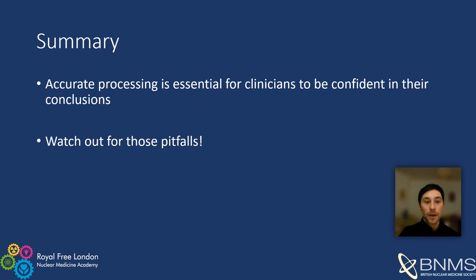To summarize, accurate processing is essential for clinicians to be confident in their conclusions. Watch out for those pitfalls.